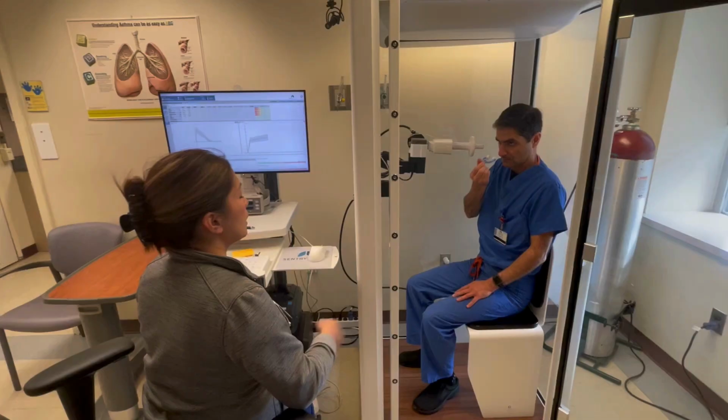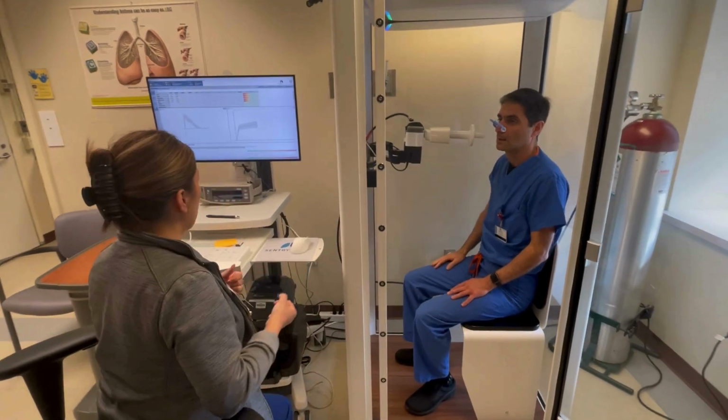I went to the pulmonary function lab at my hospital and asked the respiratory therapist to put me through a standard spirometry evaluation for COPD. This is what I learned as she coached me through the process. You're just checking to see how well you can move your air in and out.